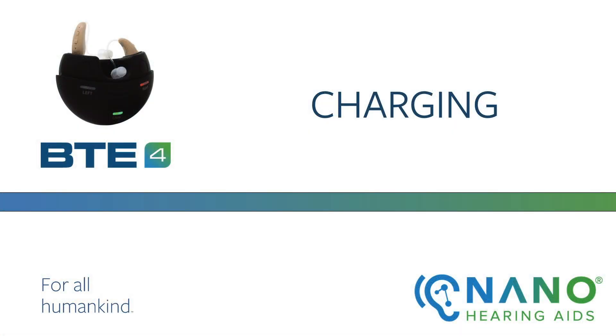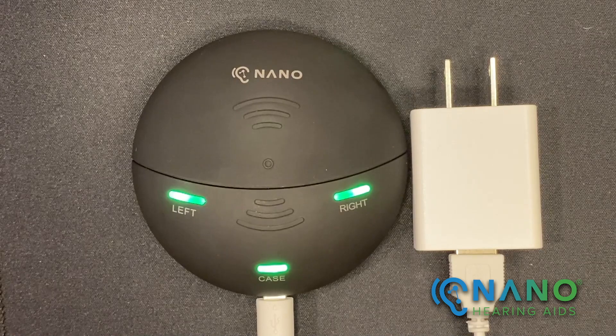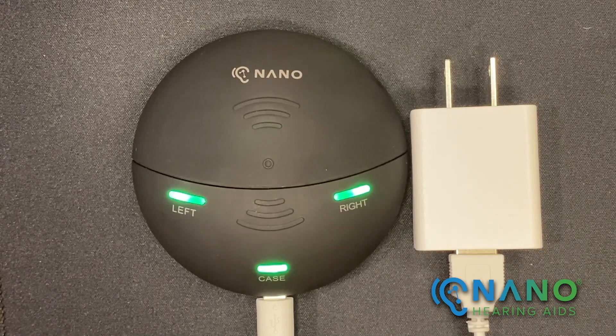Welcome to the Nano hearing aid tutorial for the BTE-4 charging case. I'll be reviewing the key features of the charging case as well as how to charge the hearing aids. All of this information can be found in the user manual on our website, nanohearingaids.com. Please note that the hearing aids should be fully charged before using for the first time.